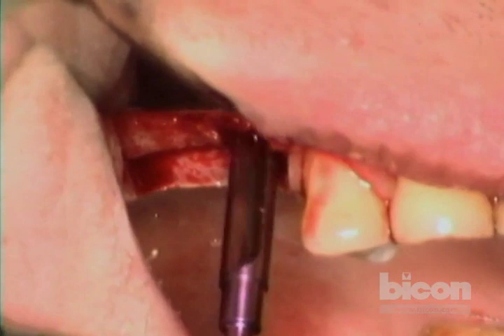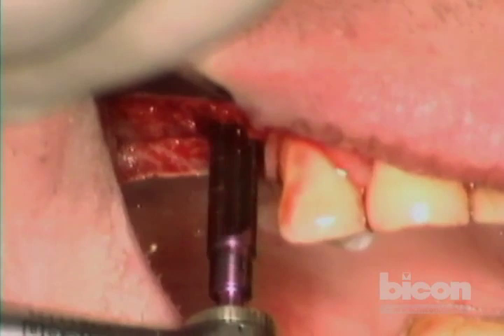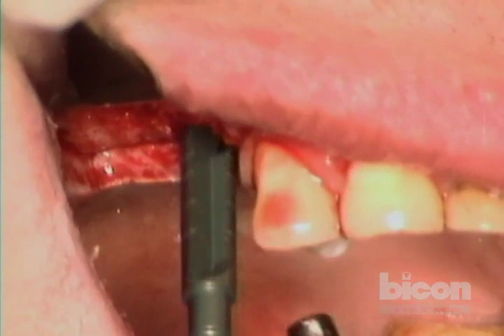We're getting all new reamers for this demonstration — I hope you appreciate the beautiful colors. There's really not much to it — you can feel what the reamer feels like as it's dragging itself into the osteotomy. We are at four and a half now, and the goal is to get to a five-diameter implant.